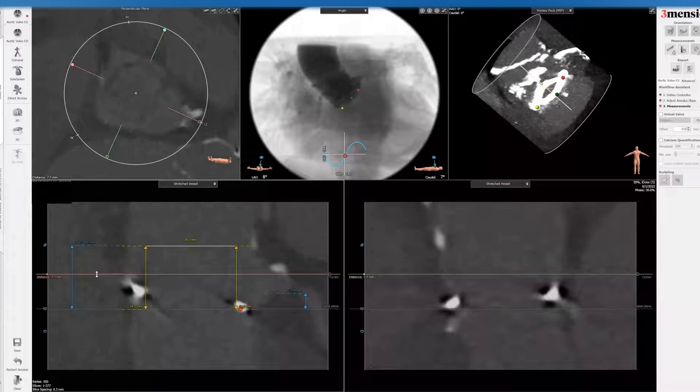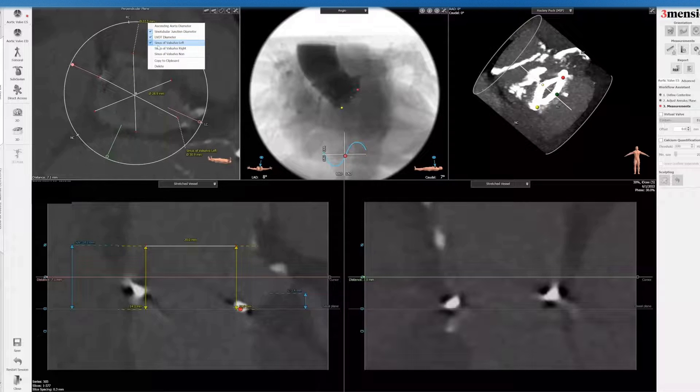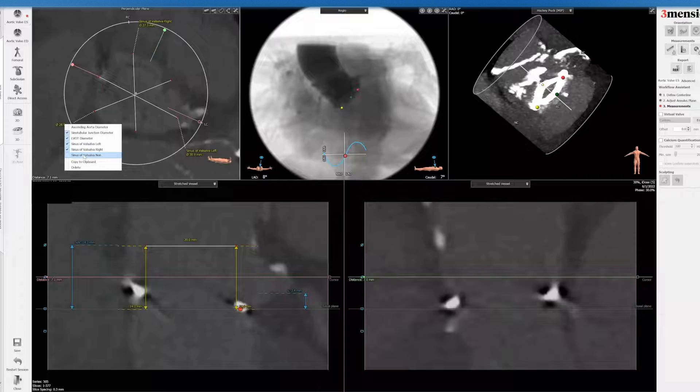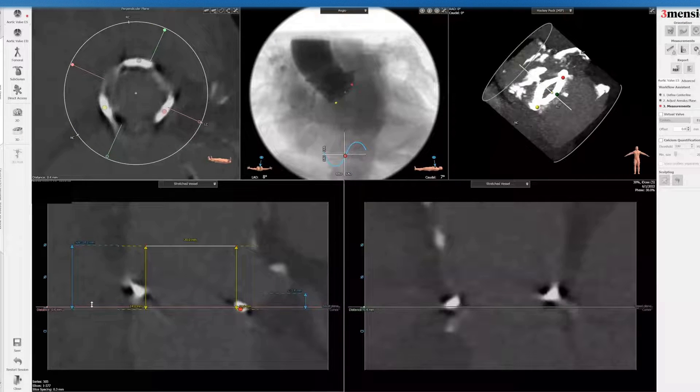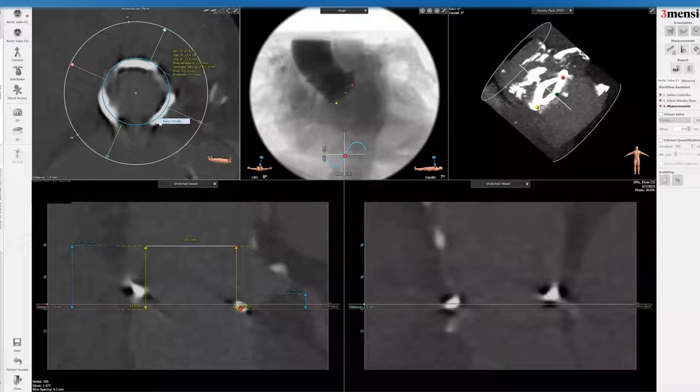Next I look at the sinutubular junction. This is a difficult measurement with this particular valve. I still go by commissure-to-sinus and commissure-to-sinus as a baseline. You can see the sinus is quite generous, though the right sinus is a little smaller. Then I go to the 1 millimeter cut and draw a 20 millimeter circle — the size of the valve I'm planning to place — based on the waist dimension from the valve-in-valve app.